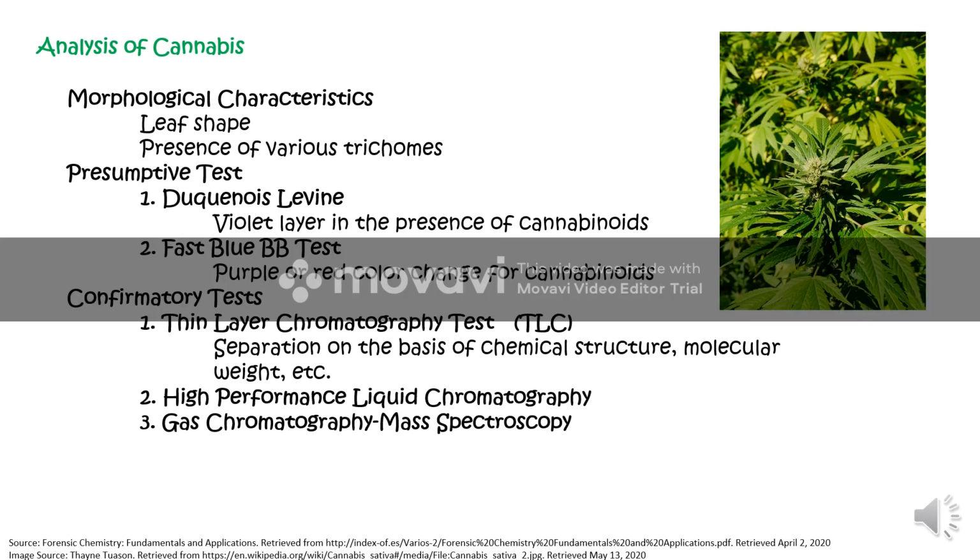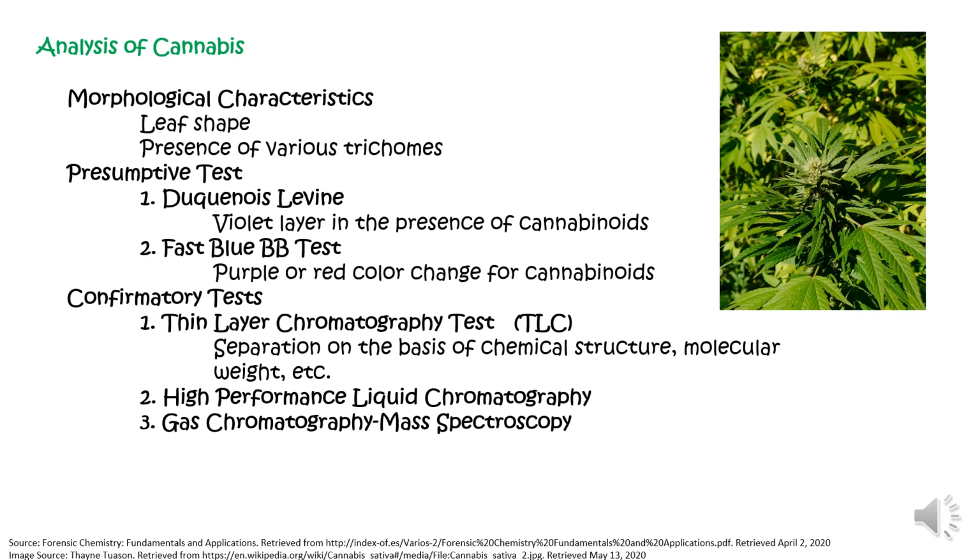Chloroform or a similar solvent will then be added, and the tube is vortexed, usually for mixing, then allowed to settle and separate into two layers. Any color that transfers into the organic layer should be recorded.